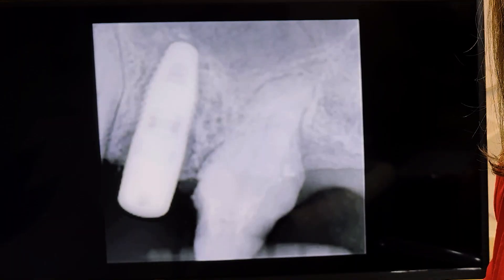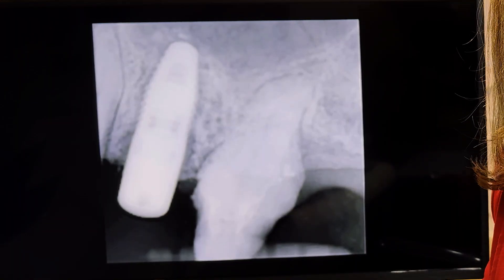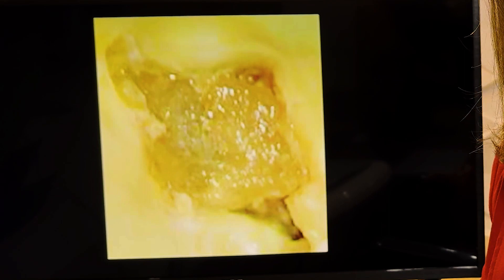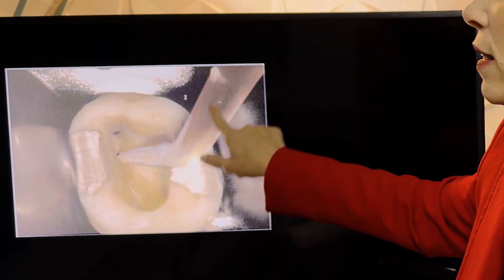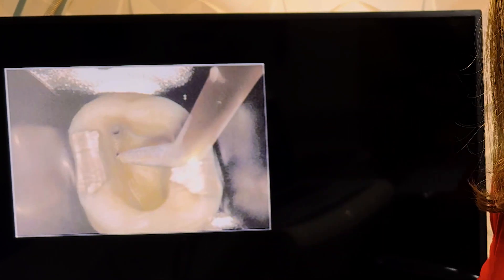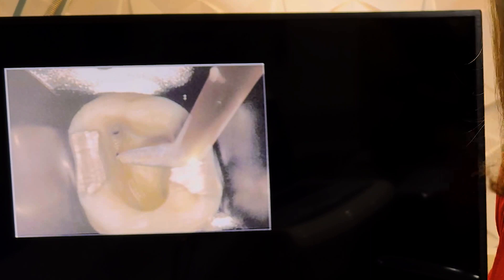Going back to our case, we need to do the access cavity. The first thing you encounter when doing the access cavity is the calcification in the pulp chamber. You need to go through that, and the main tool to add to your armamentarium is the diamond burr, so you can go inside and vibrate with the ultrasonic and remove that calcification.